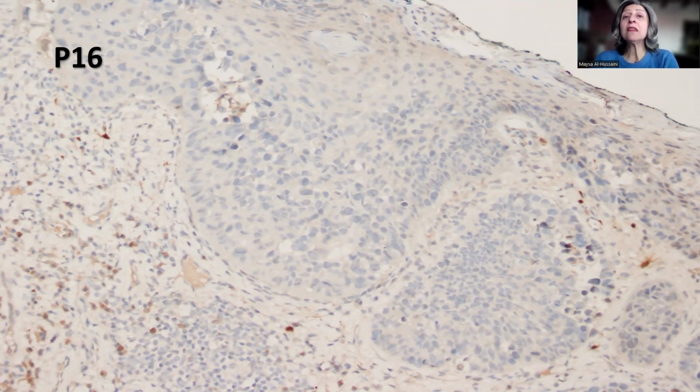However, recently a null staining pattern for P16 has been described in cervical squamous cell carcinoma, for example, and this is a case of the vulva where there is complete loss of P16 positivity. There is no mosaic staining that would really be equal to a P16 positivity, the null staining pattern.